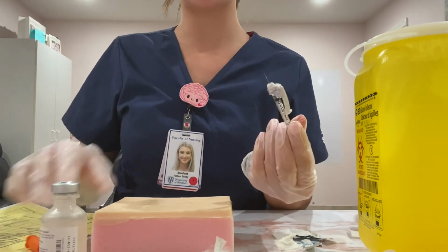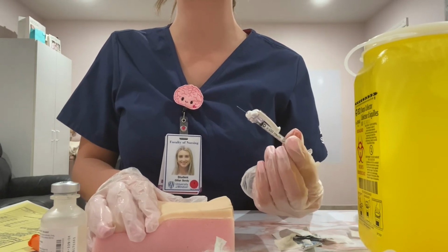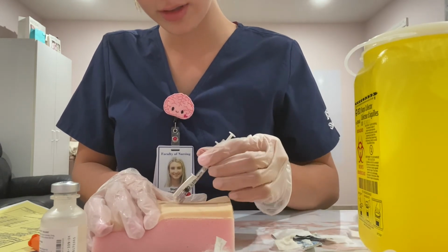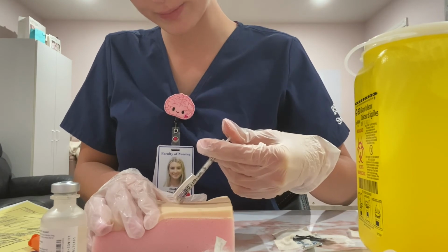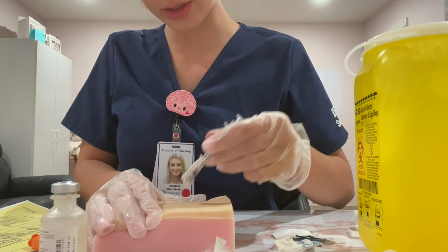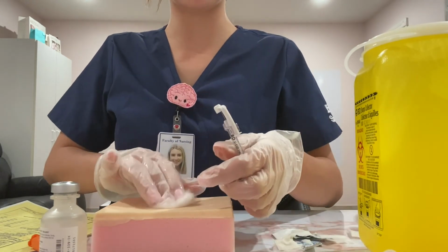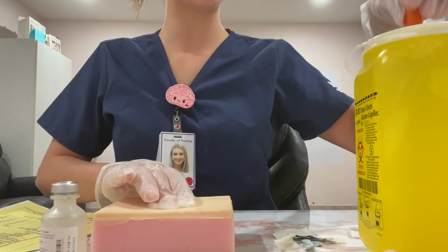And then I want to plump the skin, and for subcutaneous, you can use a 45-degree angle or a 90-degree angle. In this case, I'm going to go in at 45, administer slowly over 10 seconds, hold for 10 seconds, and then withdraw the needle, put the safety cap on right away, unpinch the skin, and swab. And then dispose of it in the sharps container.